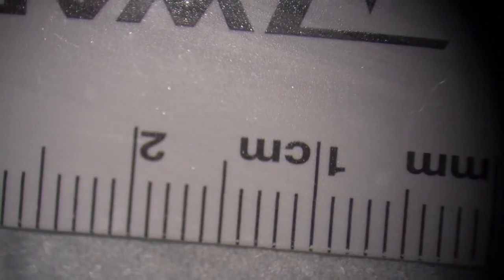Now, what is the magnification here? 0.7. Okay, go to 0.4. Step on the zoom. I'll show you how to step. Use your heel on this side, that's easier. On the other side, use your toe. We go down to 0.4. All right, and we're on 0.4.